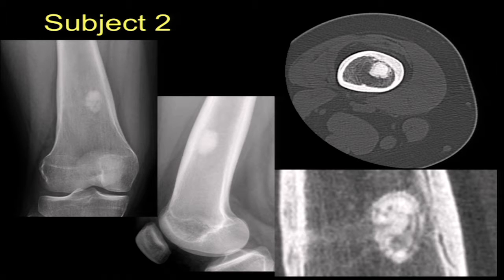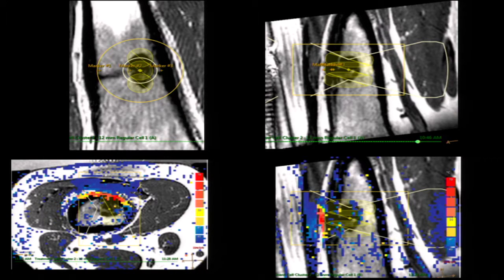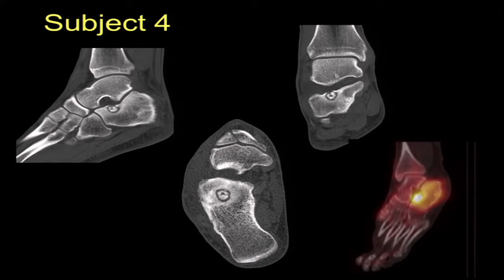This is the patient that we had only partial success with. So this is a very large, very deep, very dense lesion. This is biopsy-proven osteoid osteoma. It's a very unusual looking lesion, but it is osteoid osteoma. And despite the fact that we aggressively treated this on 2 occasions, the patient did not completely respond. So she's actually indicated that she's having some increasing pain, so we're going to be treating her with cryoablation in the next couple of weeks.